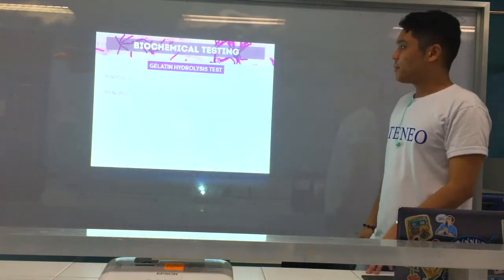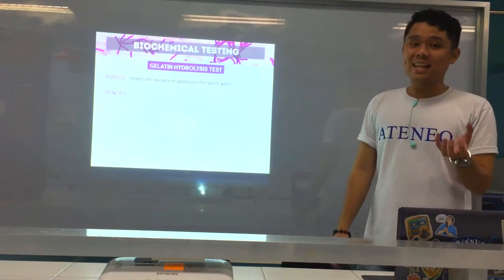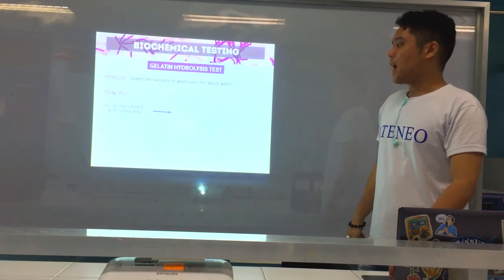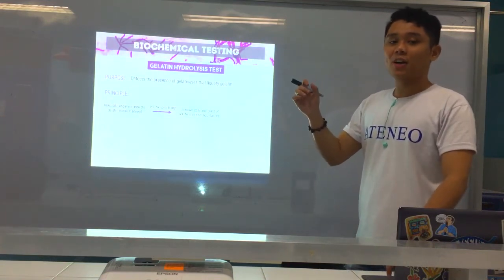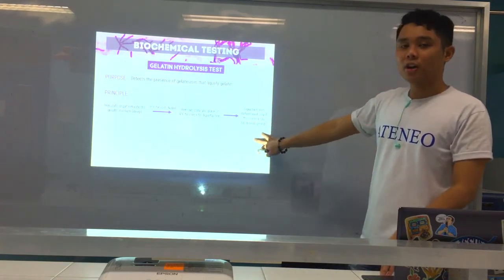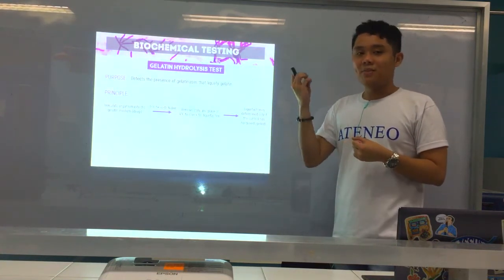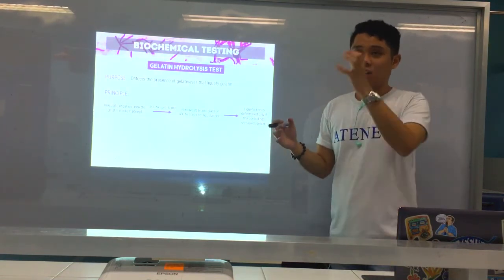Alright. Okay. Next we have the gelatin hydrolysis test. When you see gelatin hydrolysis test, think hydrolyze. Okay, so we detect the presence of gelatinase, enzymes again, that can liquefy gelatin. Okay, so again, we inoculate the organism into a gelatin medium, which is a deep, okay, or a butt. And then we incubate for up to 14 days. And then we remove it daily and place it at 4 degrees Celsius to check for liquefaction, meaning whether it has liquefied, meaning it has become liquid. Okay? And we observe for liquefaction if the control that we prepared has hardened, meaning we have a control, which is an uninoculated gelatin medium, and once it has hardened, that is where we confirm the liquefaction in the inoculated tube.